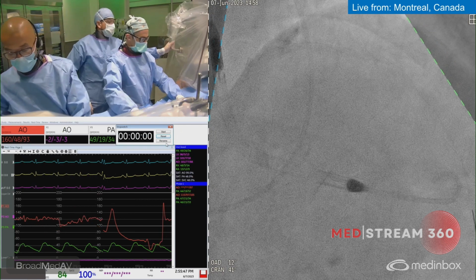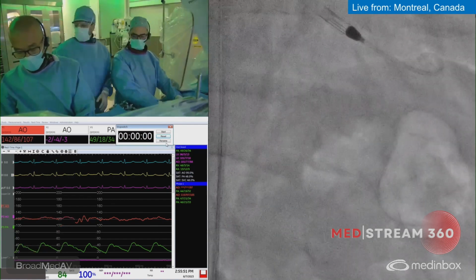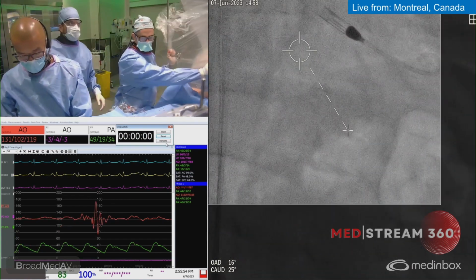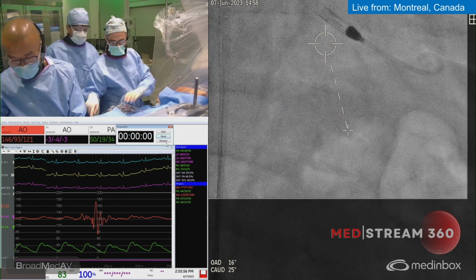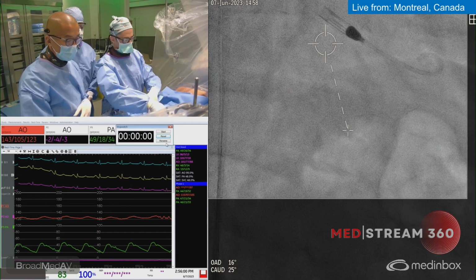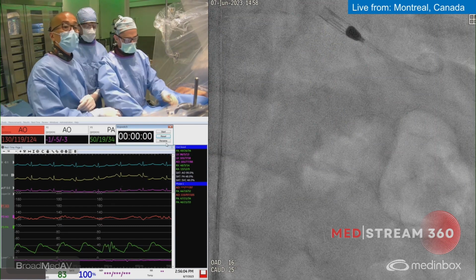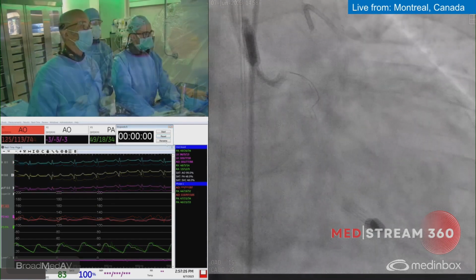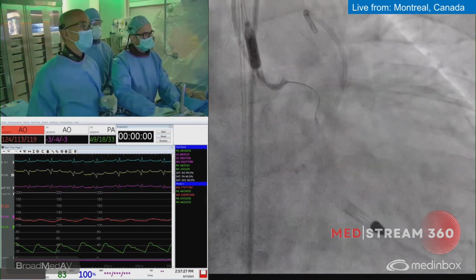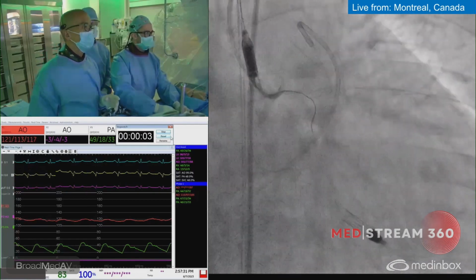And the OCT helped us guide what we were planning for left main prox LAD PCI. However, it wouldn't advance despite having that 7 French guideliner in place. Right now, for the time being, things are actually pretty stable. How does it feel? Well, it feels like a CTO. I mean, the wire is not progressing.